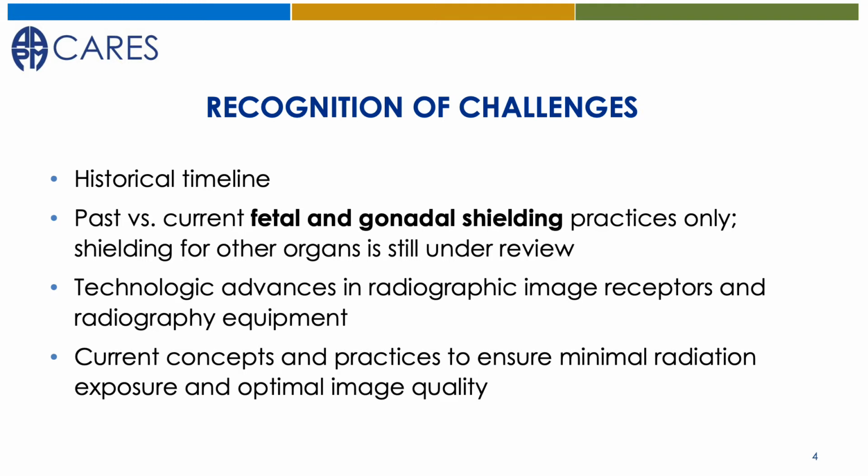It is important to stress that this change in shielding only applies to abdominal shielding of the reproductive organs and the fetus during abdominal and pelvic imaging. Shielding of the thyroid gland during dental radiography and mammography, shielding of the breast tissue during scoliosis radiography, and shielding of the lenses of the eye are still appropriate clinical practices. This module is focused on helping us all move to a new paradigm based on current evidence-based science regarding the discontinuation of fetal and gonadal shielding.